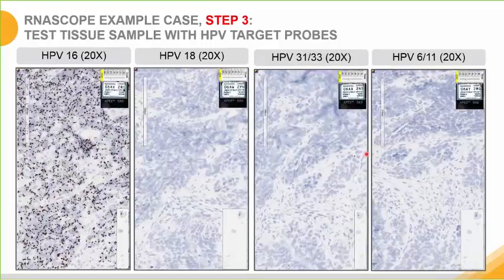In step 3 of the QC example case, tissue sample is tested with several different target probes now that it's been qualified as having intact RNA without significant background staining. In this case, the target tissue was stained with several probes for different HPV subtypes, including HPV-16, HPV-18, HPV-31, and 33, performed in a duplex assay, as well as HPV-6 and 11, again performed in tandem. You can see that HPV-16 is strongly positive, whereas the other HPV subtypes are negative, indicating that this tissue is positive for infection by HPV-16.